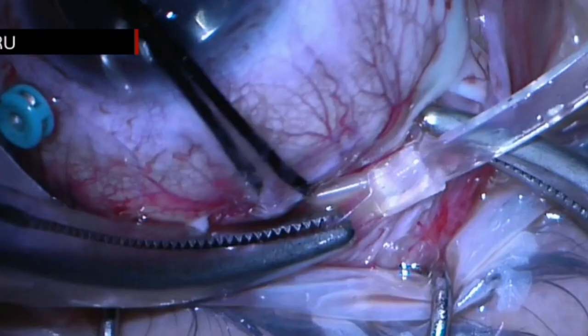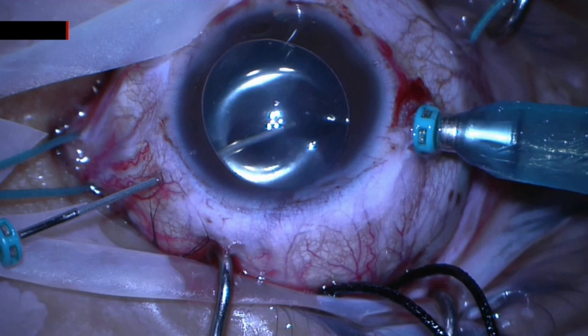The fluid-air exchange was made without retinal slippage, and we can see better under air an area of choroidal detachment temporally. Before the fluid-air exchange, the surgeon performed an inferior iridotomy. The buckle indentation was tightened under air and silicone oil was implanted at the end of the vitrectomy.